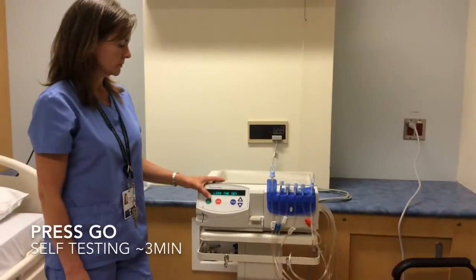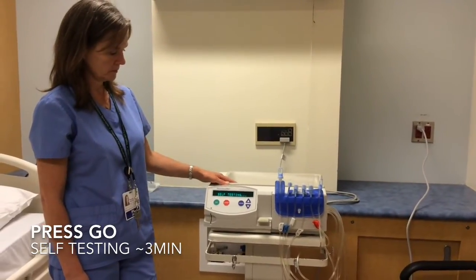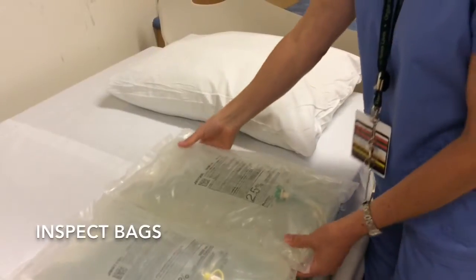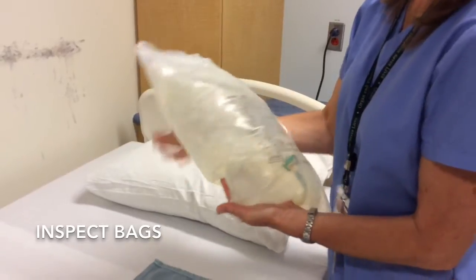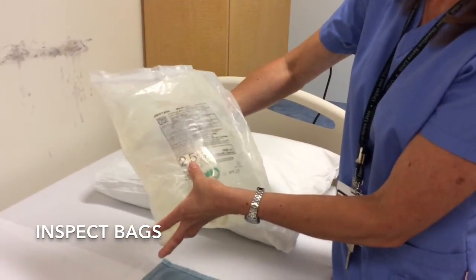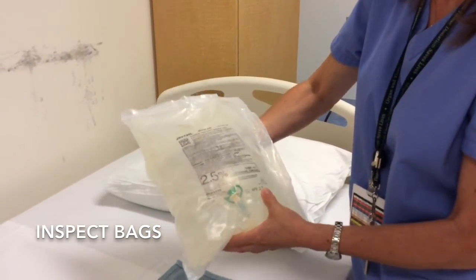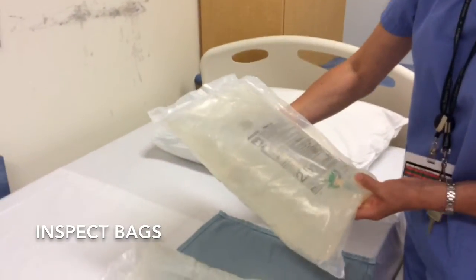Press go on the machine — it will be self-testing, which takes about three minutes. During this time, inspect the bag. This is a five-liter bag. Make sure you have the right concentration. The expiration date is in the lower right-hand corner. The solution is clear, the bag has not been tampered with. You can use this bag.